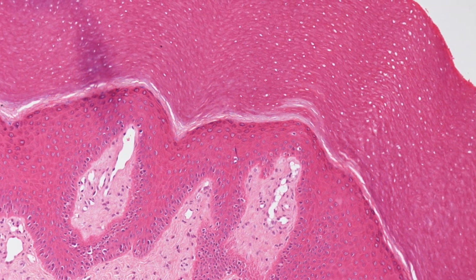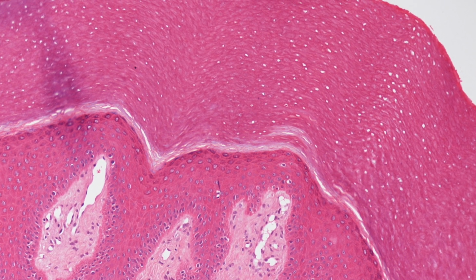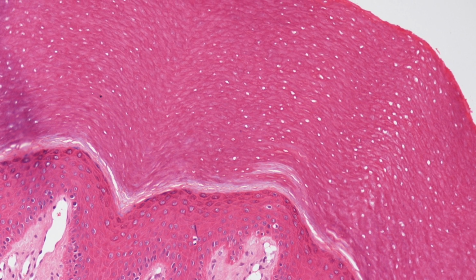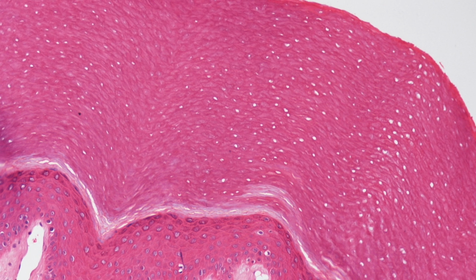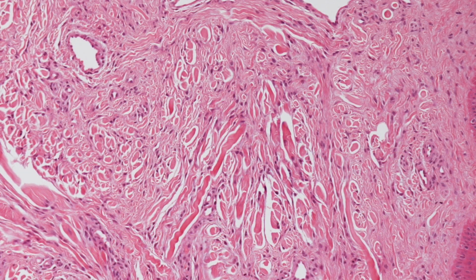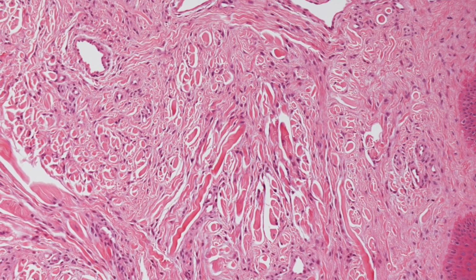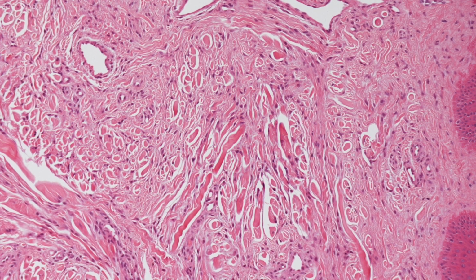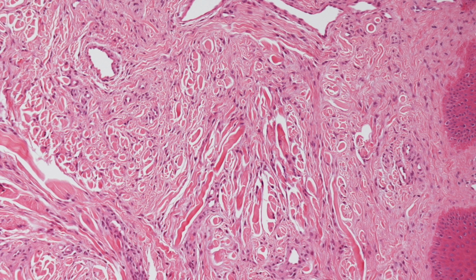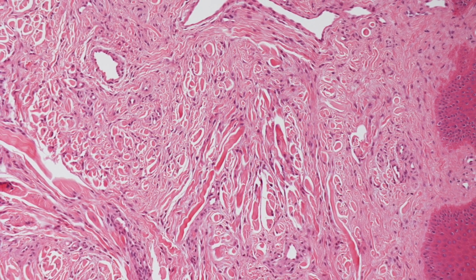And a closer look at the hyperkeratosis reveals that there is absence of nuclear remnants, so this is a thick layer of orthokeratin. And this is the core of the fibrokeratoma, showing bundles of collagen, some vertically orientated, and also the lesion is quite vascular.